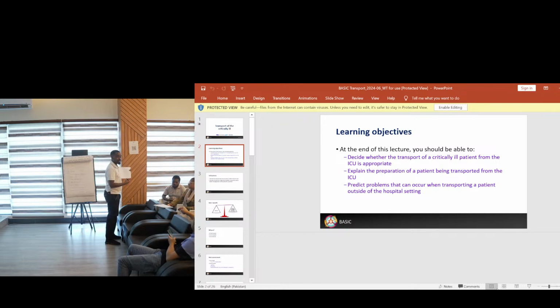The FiO2 is in decimals. If it's 50% FiO2, it is 0.5. So 0.5 times the minute ventilation, maybe 6 liters per minute. So 6 times 0.5, you get 3. You put 3 down here, and then you get your minutes.